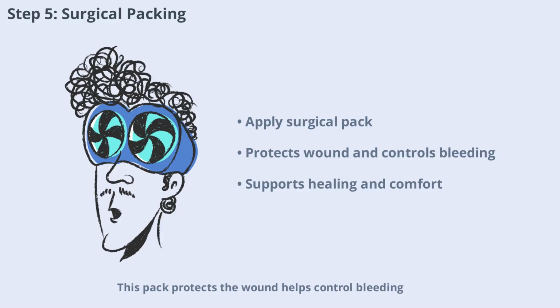This pack protects the wound, helps control bleeding, and supports the healing process. It also provides comfort to the patient during the initial recovery period. Proper placement and retention of the pack are important to prevent complications and promote optimal healing.